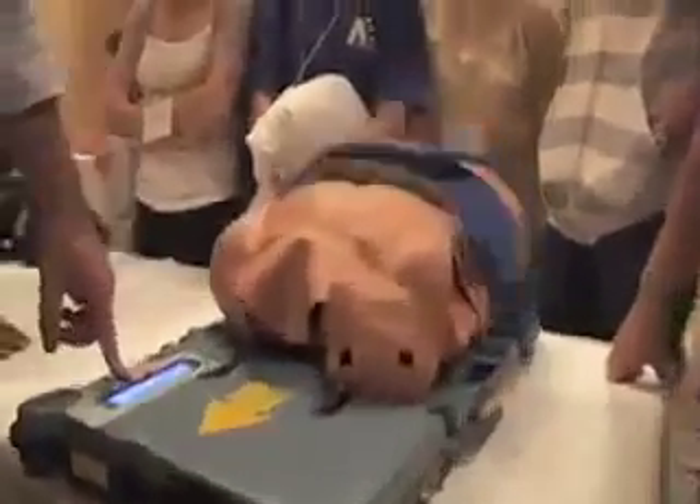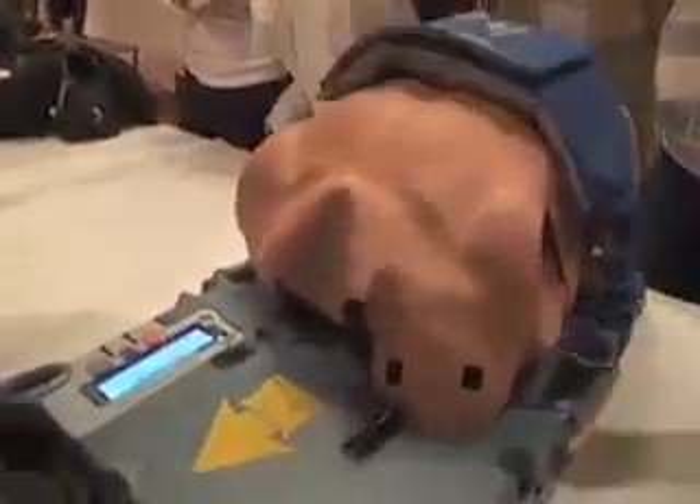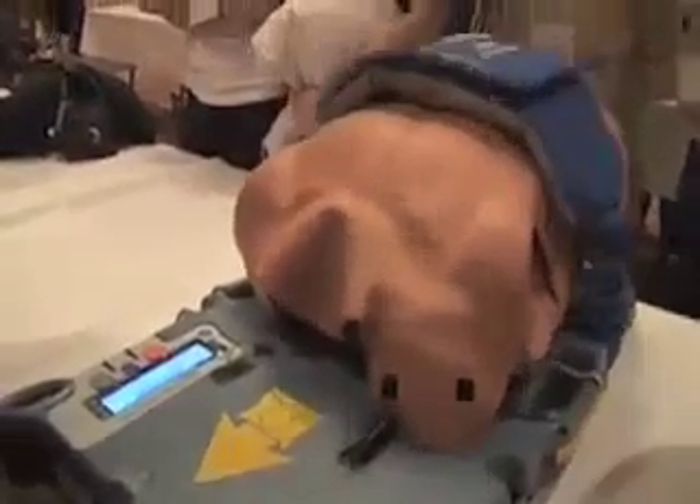That's the machine, and it goes. With the patient's tube and a line in, I'm just going to switch them to continuous and not stop. In rural Amos, Victoria, they've got seven machines.